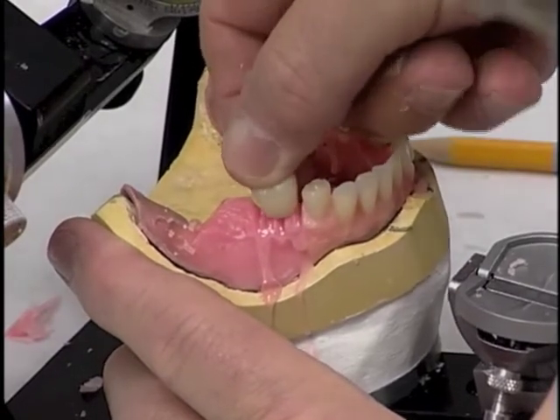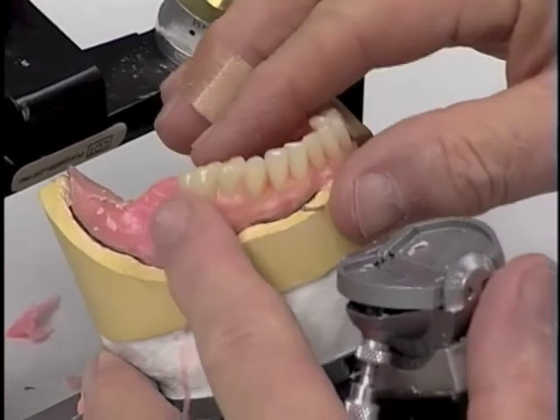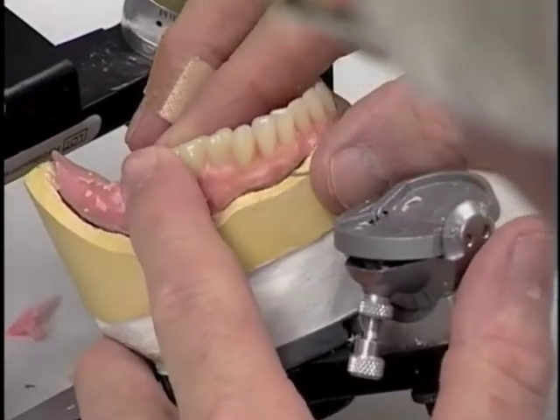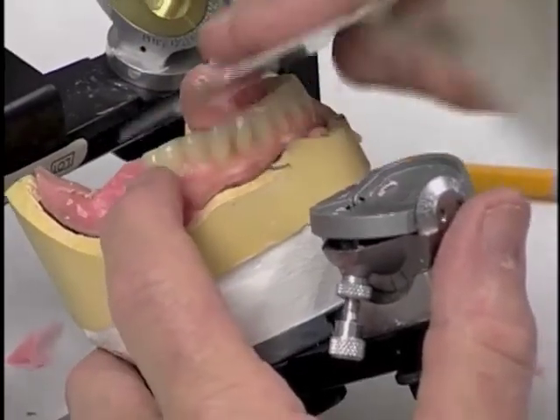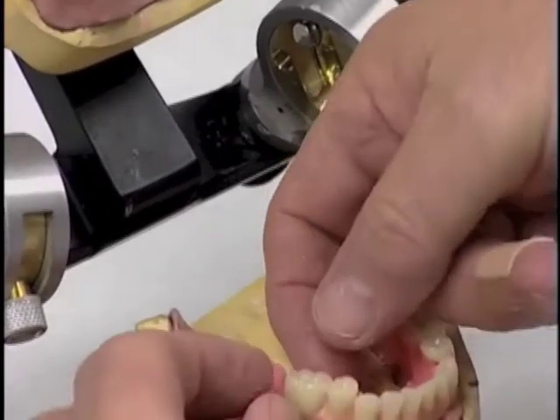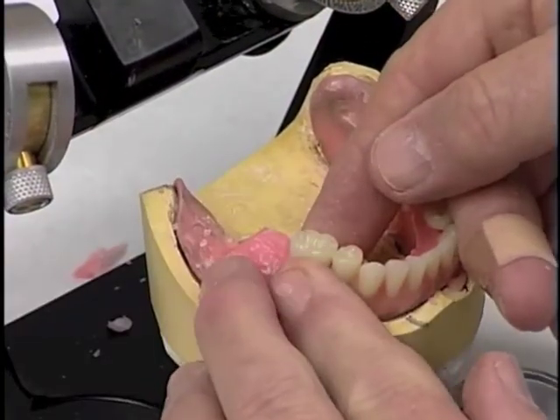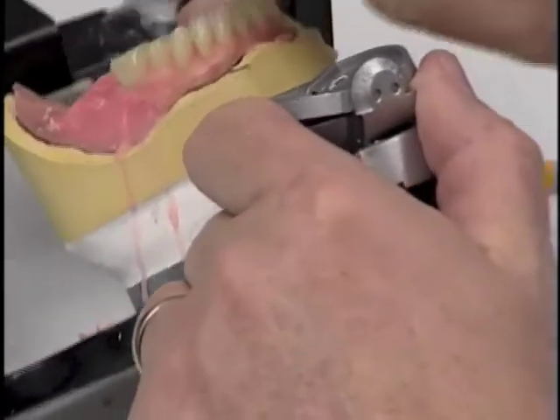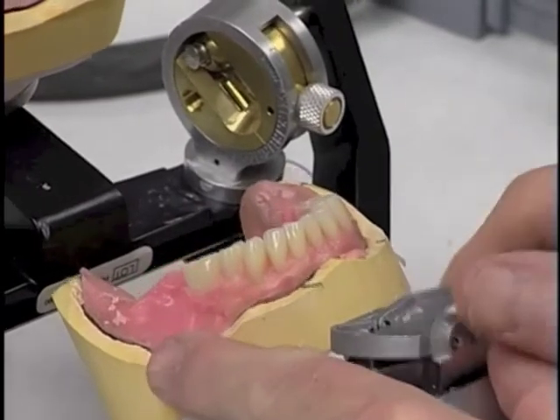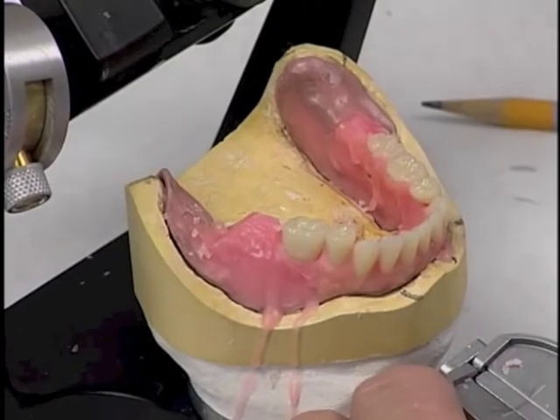And we place the tooth in the area we would like it to be, checking our alignment as we go, using our flat plane guide to see that we're keeping it on a flat plane, and we find that the lingual cusps are a little depressed right there, so I'm going to lift the lingual cusps a little bit. Now they appear to be aligned properly, and we'll go on and pull wax.